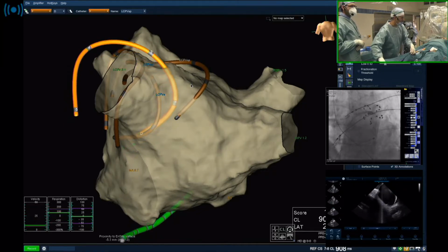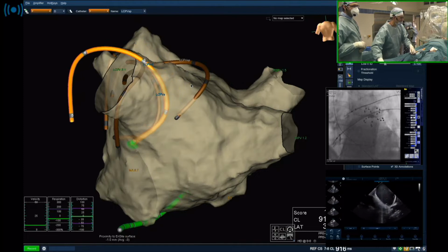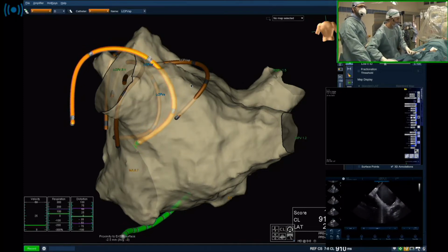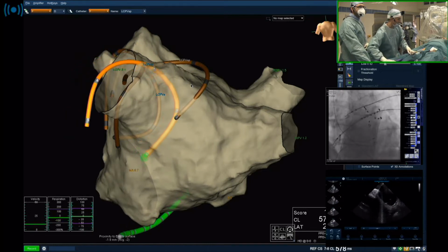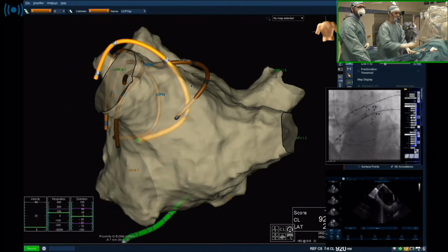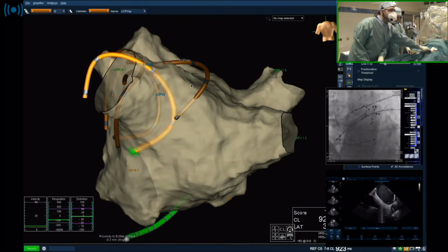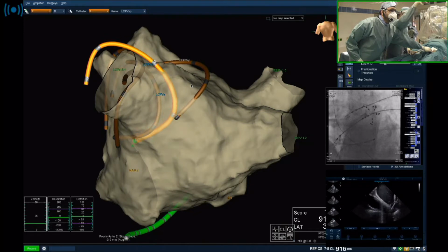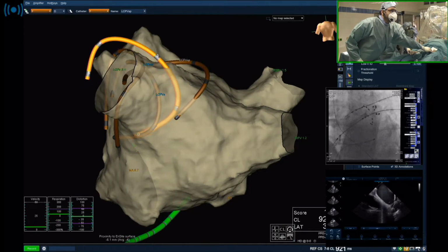Why don't we keep it fully inside? Keep it like this. That's fine. Okay, let's do this. I'm pushing too much. Yeah, keep the wire. Much better. Leave the wire. Now we're fine. Now we are oriented like a hockey stick. That's fine. LIPV, pulse 1.